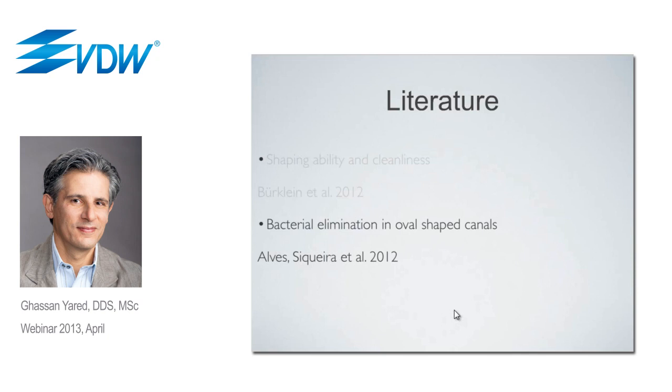There are also studies that have shown that the bacterial elimination with the WaveOne and the Reciproc instruments is as efficient as using the BioRaCe sequence.